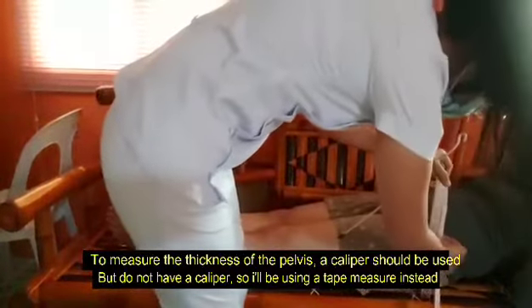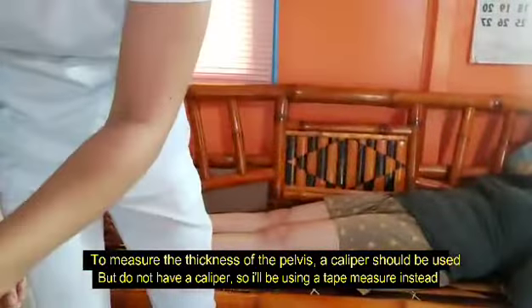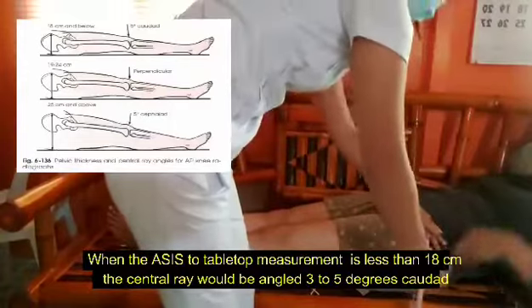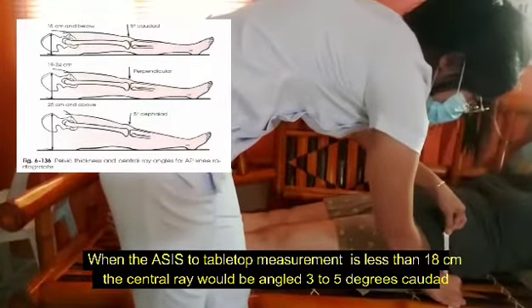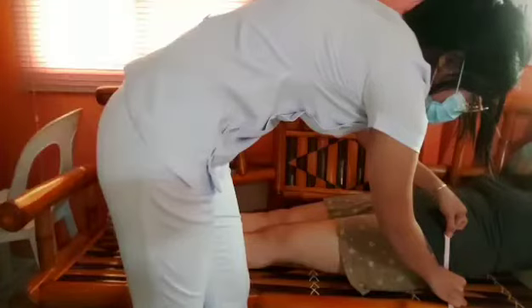I'll be using a tape measure instead. When the ASIS to tabletop measurement is less than 18 cm, the central ray would be angled 3 to 5 degrees caudad for both AP projections and AP oblique projections.